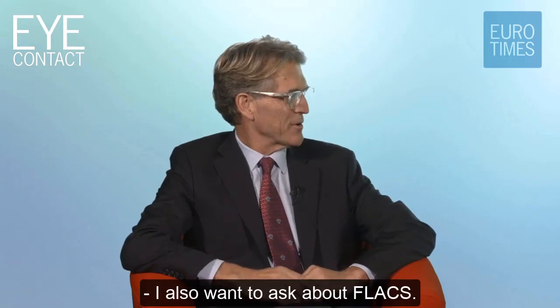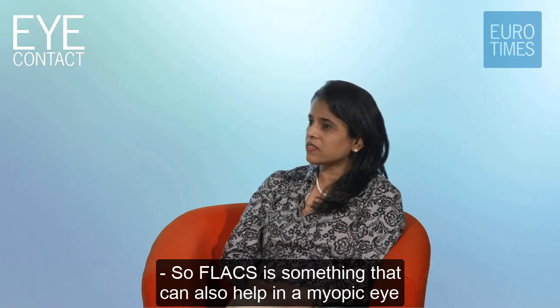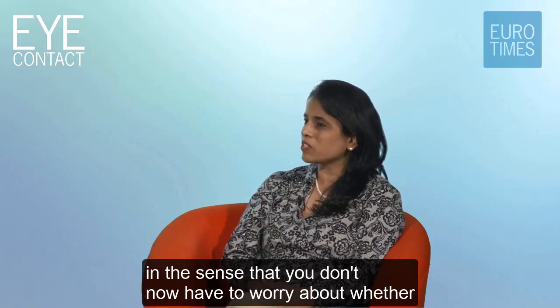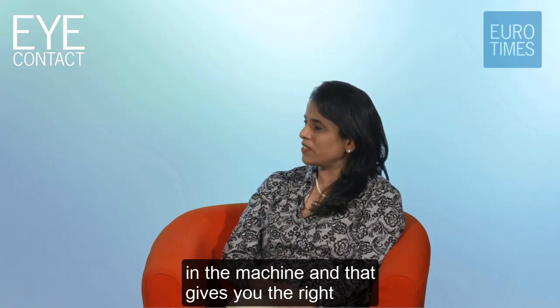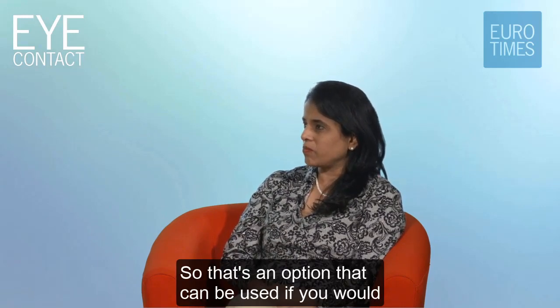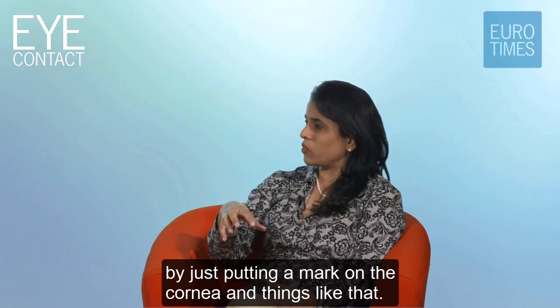I also wanted to ask about FLACS. Where does that fit into this equation? Yeah, so FLACS is something that can also help in a myopic eye, in the sense that you don't now have to worry about whether your rhexis is accurately sized, because you're not eyeballing it. You have the measurements in the machine, and that gives you the right accurately sized rhexis. So that's an option that can be used if you would want to, though there are simpler ways of doing it by just putting a mark on the cornea and things like that.